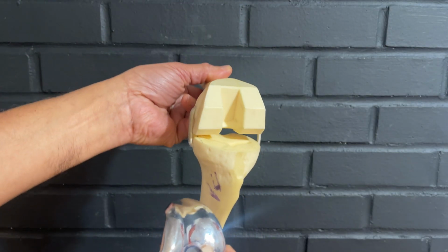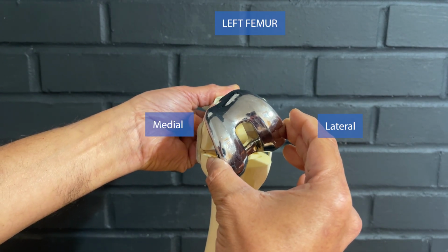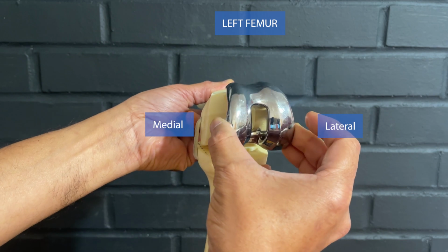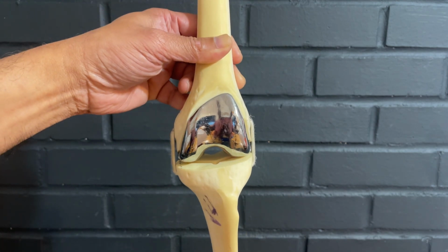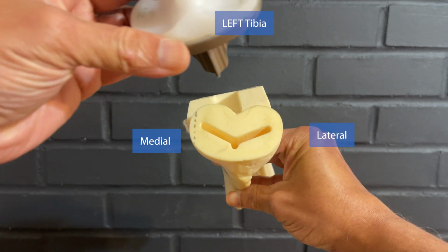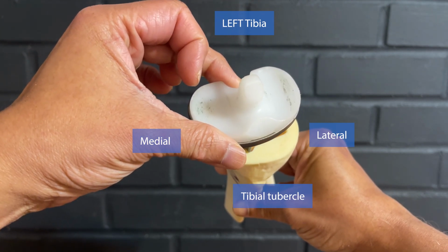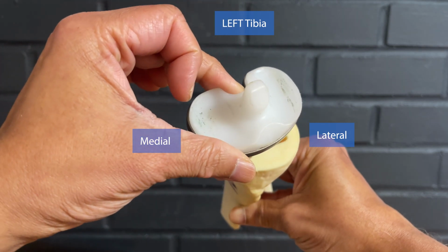For the left knee, this would be considered internal rotation of the femoral component, and this would be external rotation. For the left knee, on the tibial side, this would be considered internal rotation, and this would be external rotation of the tibial component.